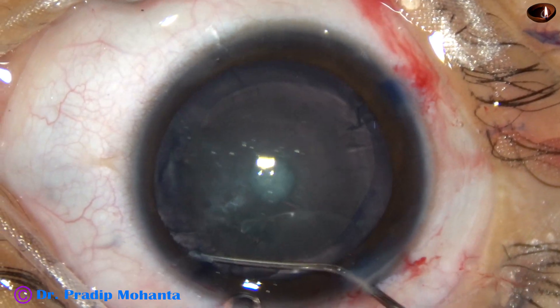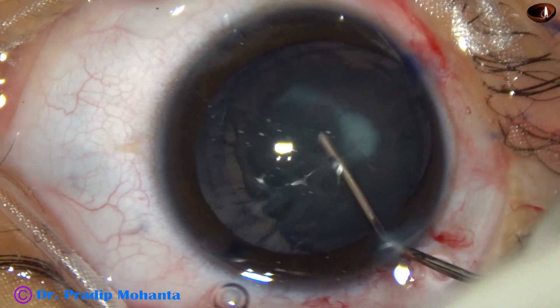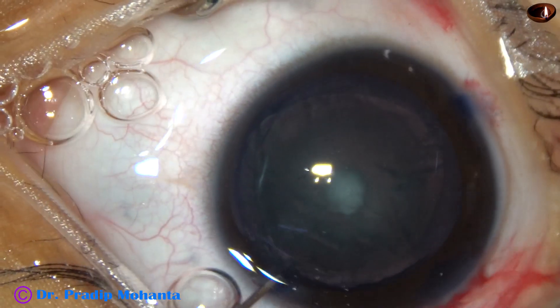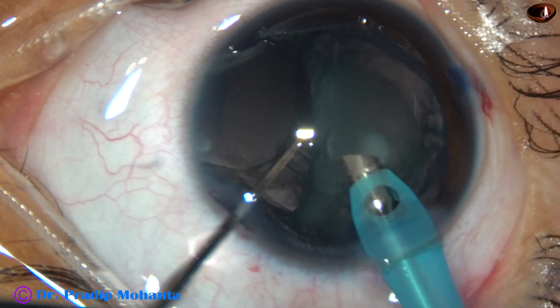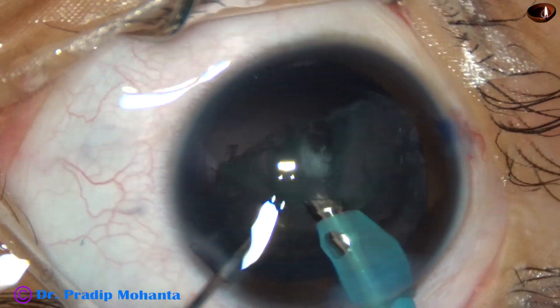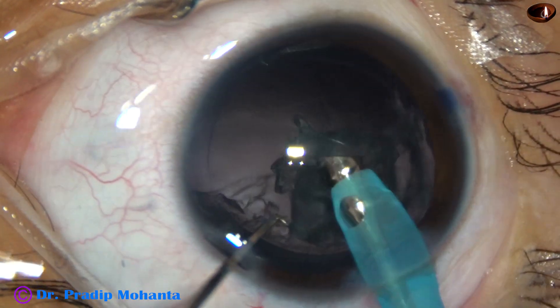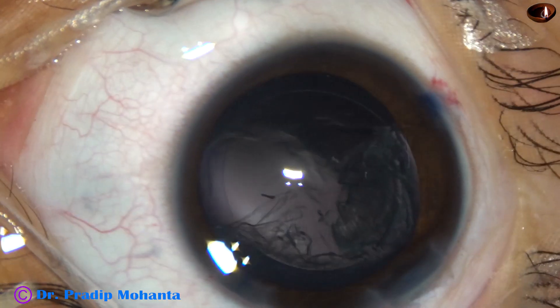Now hydrodissection is being done. You can see the fluid wave goes to the other side. Now we can use bi-manual irrigation aspiration to remove this lens matter, but it takes a longer time. This cataract is sticky and there is some hard part at the center, so it is always better to use the phaco handpiece. Go bevel down and make the bevel up at the right time, and see how easily we can remove the lens matter. We can use very little ultrasonic energy — say about 10% — when it is required and when the lens mass occludes the tip of the phaco handpiece, and in no time the lens matter is removed.